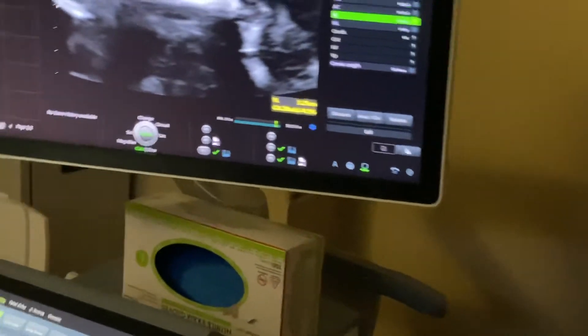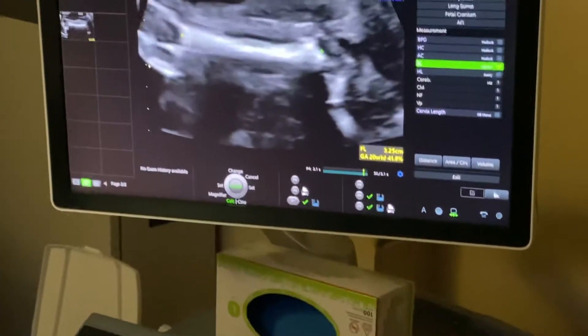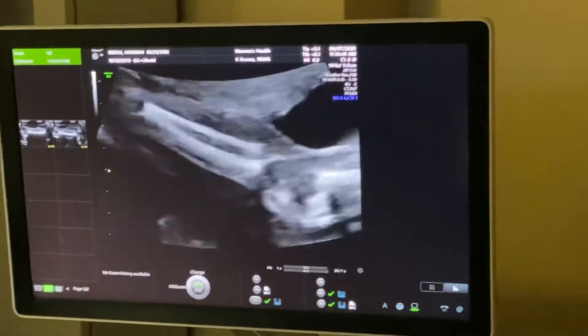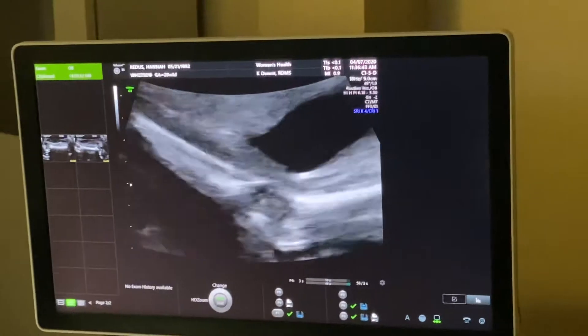FL — femur length — 3.25 centimeters. And that says we're 20 weeks and a day.